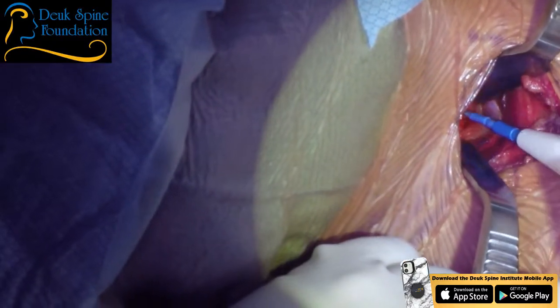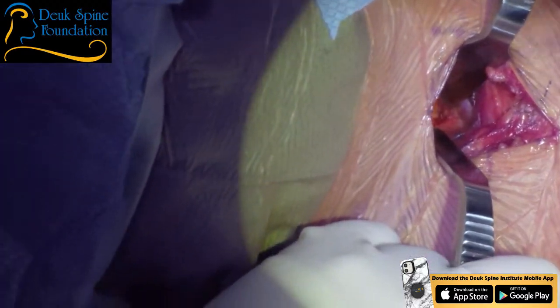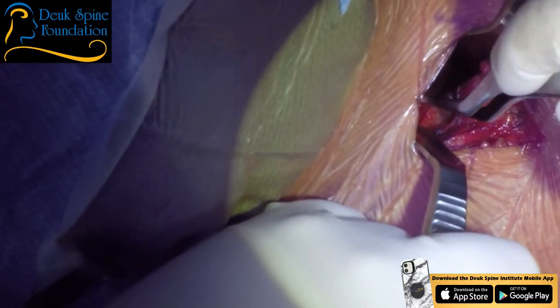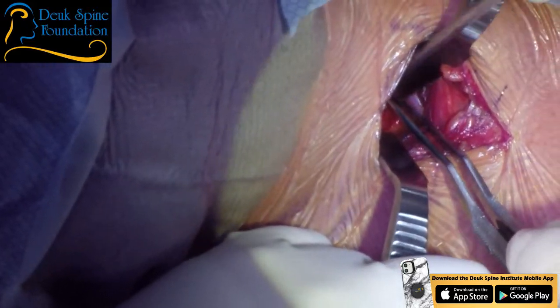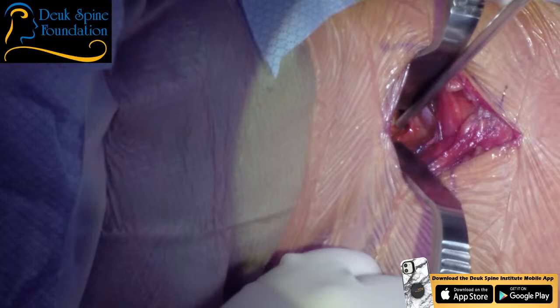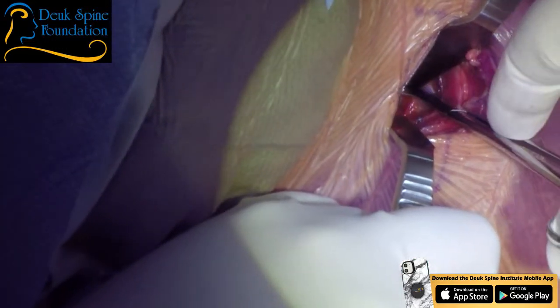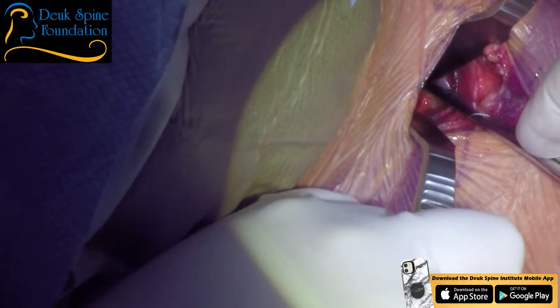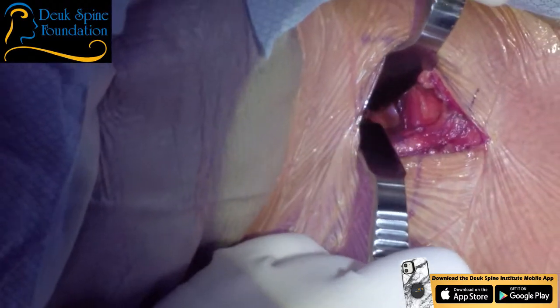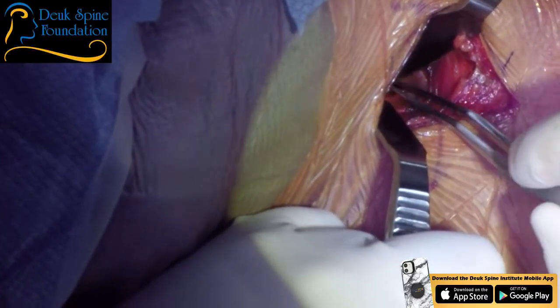How's blood pressure? Good? Yeah. Everything good? Bipolar? Yes, so we're just down here, you know, right over the disc space, and I need to verify that we're in the right disc before I start any kind of discectomy. Scissor? So I want to use the x-ray another time. Bipolar. Ready? Go south just a little bit, Dr. Patel. There you go. Thank you.